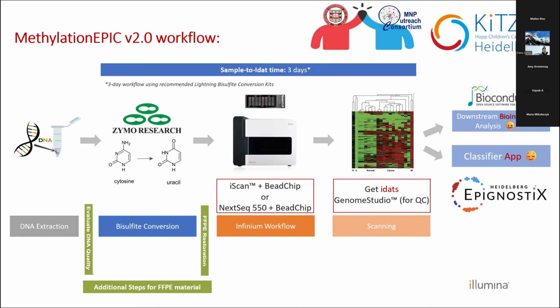In addition to that, the protocol that has been developed in Heidelberg by Arpita Patel and other colleagues at neuropathology has really been well developed now to shorten the time to 30 minutes intraoperatively. So yes, thanks a lot for highlighting this development. This really provides a lot of valuable information on time for neurosurgeons and for decisions for the patients, of course.